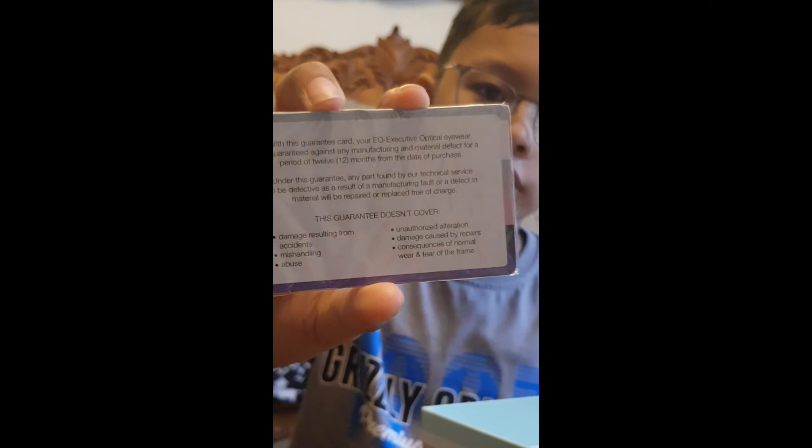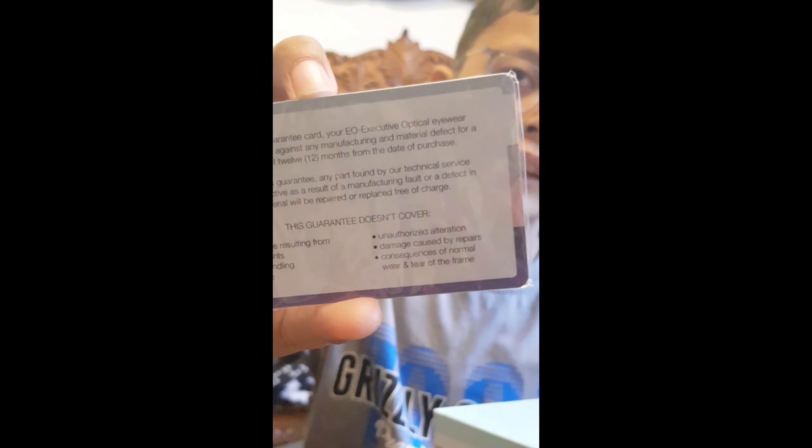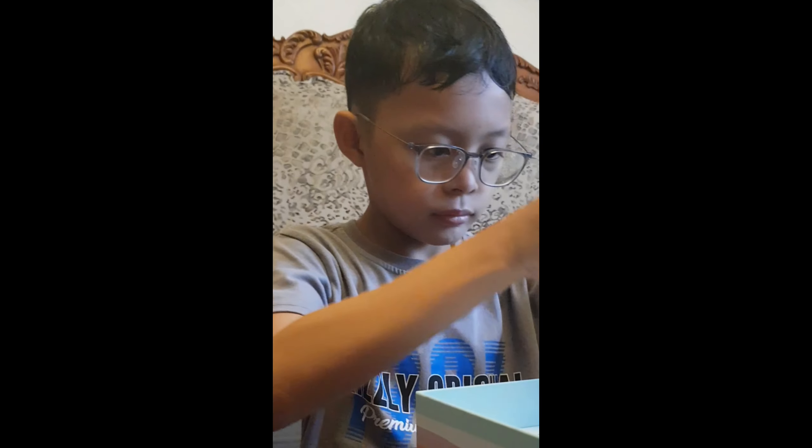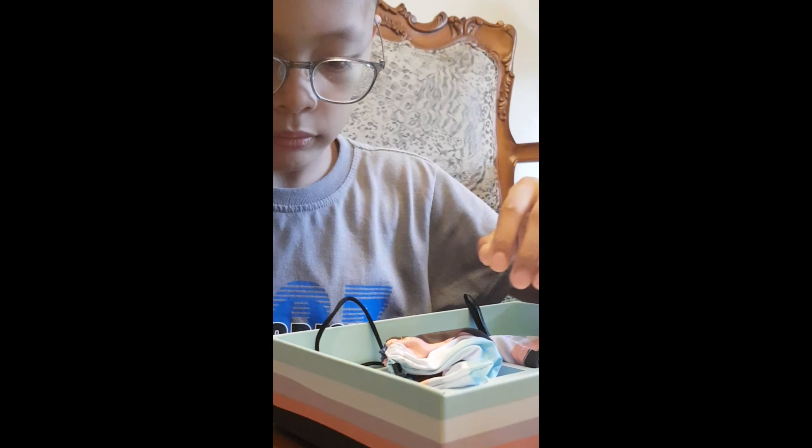If you have this card, just read the back so you can see what's the writing, so you'll know how to use your eyeglass. This is the do and do not.